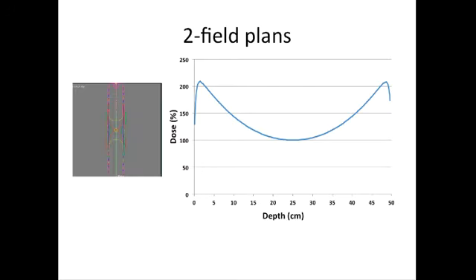You can reduce this inhomogeneity in various ways. One way is to increase the energy of the beam. Here I'm showing the blue from before. That was a 6 MV beam. But now if you use an 18 MV beam in green, you see the hotspot is greatly reduced. That's because the penetration is higher. Essentially, the PDD falls off less quickly for an 18 MV beam, so when you superimpose them, it's more homogeneous. The same effect will play out for the other factors that you've studied, for example, the field size dependence. A large field size falls off less, and so it has less of an inhomogeneity.